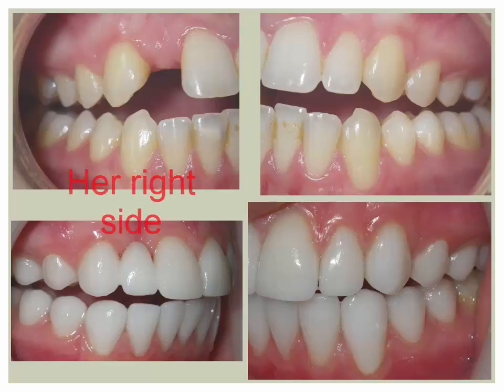Here, to the left, is her right-hand view looking at that space. It looks like plenty of room for an implant in this view, but when you take the x-ray, the neighboring roots aim toward each other and there's no room for the implant up high. So on the bottom, on the left, which is her right-hand side, you can see the permanent bridge. And we veneered her lower teeth too to get everything nice and pretty. And then on the right-hand side of the picture is the view of her mouth from her left side. And in fact, on the top, you can see the little splotching, the indentations of a lateral incisor, and then we put the veneer on it, and they look gorgeous.